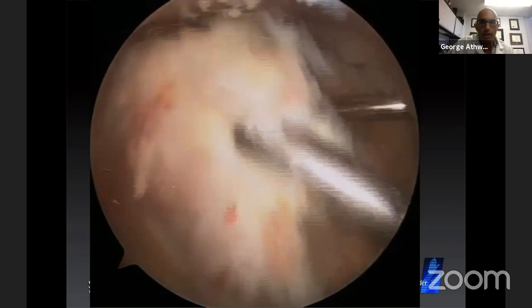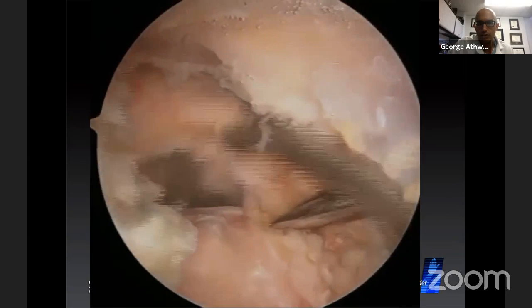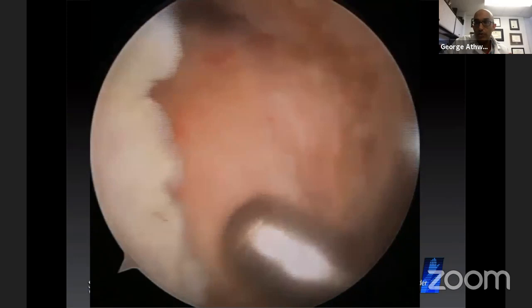Here's the subscapularis tear, right there. There's the lesser tuberosity. There's the tear. This is the supraspinatus attached onto the greater tuberosity, intact. And I'm going to repair the subscapularis down to the lesser tuberosity. So now I can go ahead and debride the lesser tuberosity from the front. So I'm viewing from the front. There's the biceps groove. There's the lesser tuberosity footprint of the subscap.